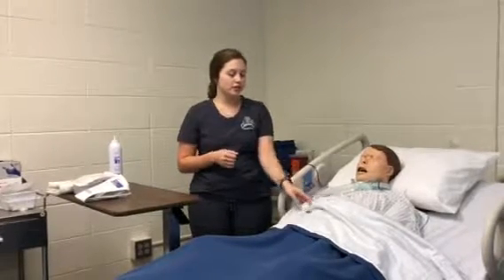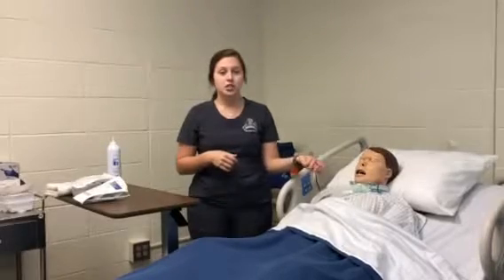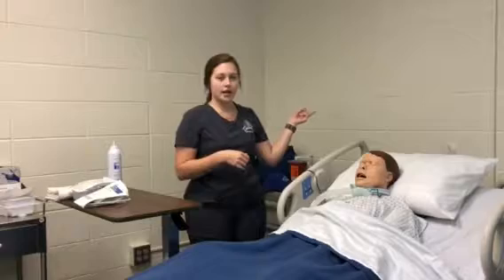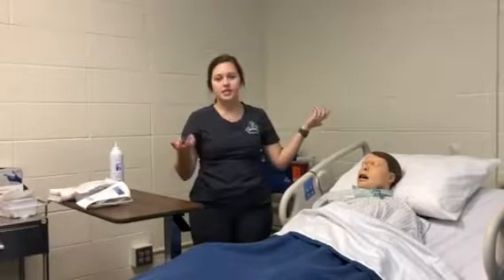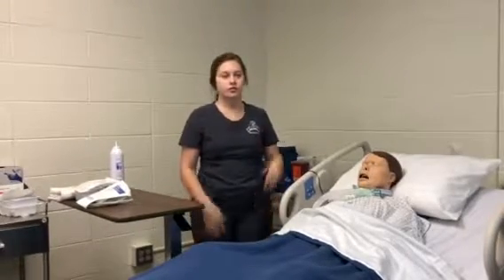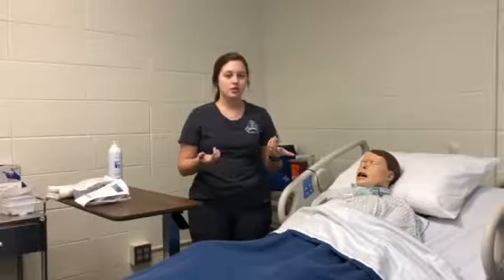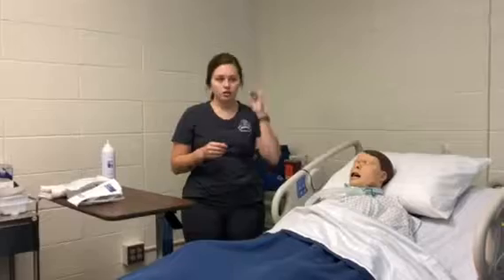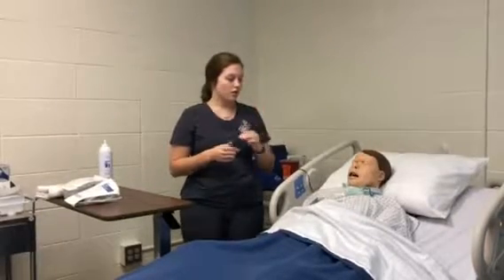Another important thing to do is make sure that we hyperoxygenate our patient. So I have my oxygen on and it's the highest it can go. Because of the lab we're in, we don't have the control panel, so we're also going to be simulating our suction today, as well as our oxygen. So let's go ahead and get started.